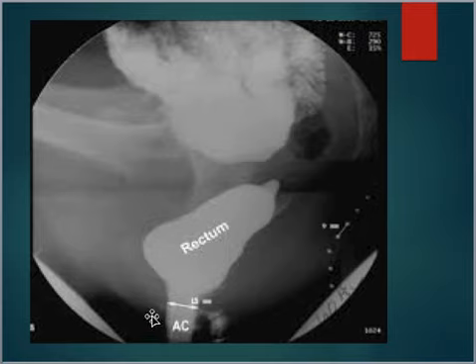We're looking to see, they're measuring here for the anus. They're looking to see how things are operating, if the muscles are loose and tightening properly, and what's going on with that function.